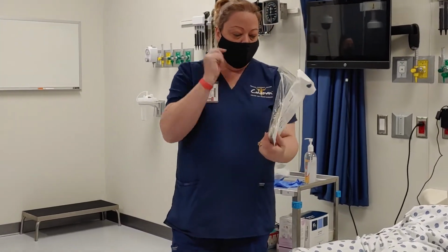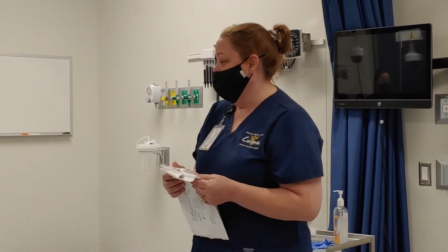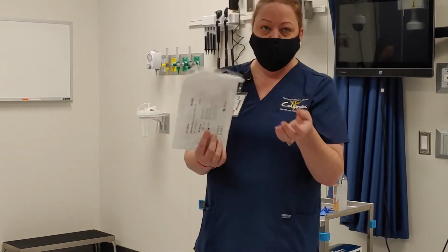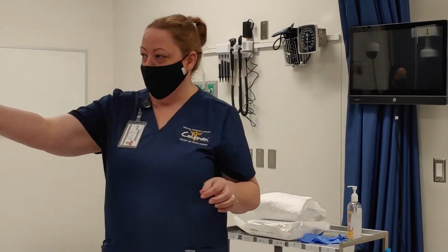This one is an intermittent catheter, so if you have people that have to catheterize themselves, or we can actually use these in the hospital as a straight catheter, okay? We put it in, we drain the bladder, we take it out. All right, so here's another sample of those. We'll pass that around.